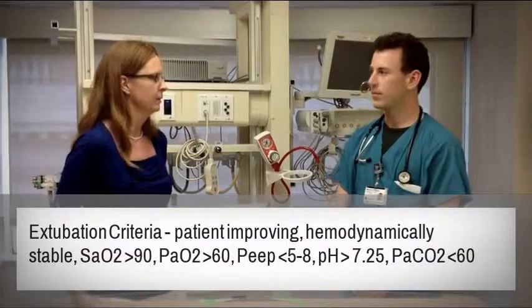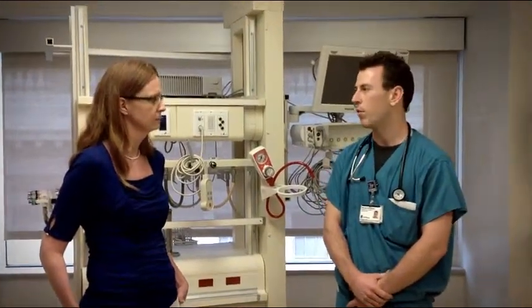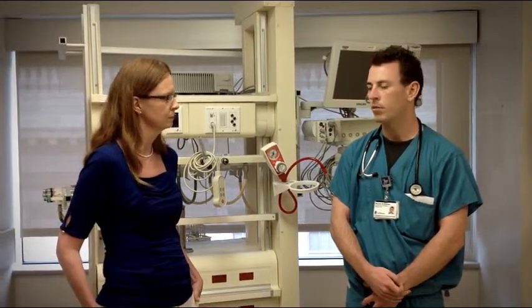Okay, and how do I know when the patient's ready to be extubated? What am I looking for? So you're going to want them to be able to spontaneously breathe on the ventilator. You want them hemodynamically stable, blood pressure, sats, heart rate, all within normal range. And you switch them over to that spontaneous mode of pressure support. You have them on the minimal amount of pressure support, and you leave them on there for about 30 minutes. See how they tolerate it.